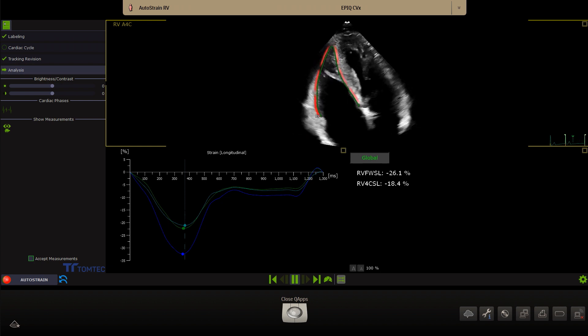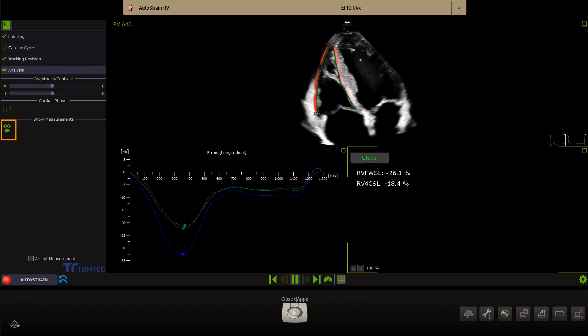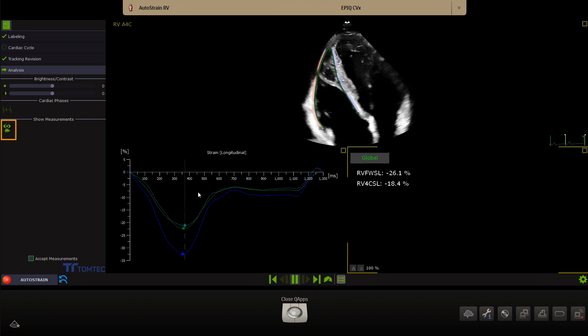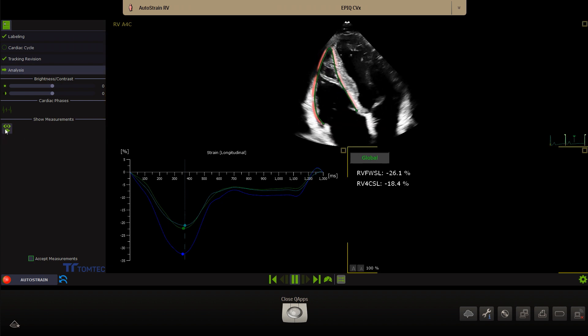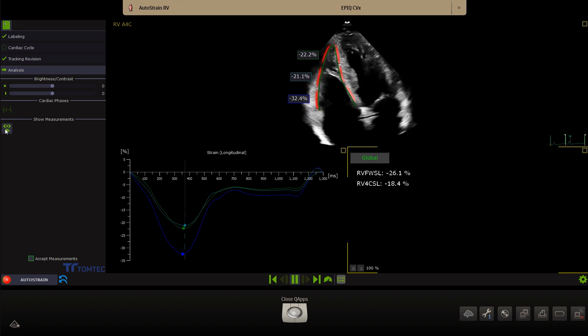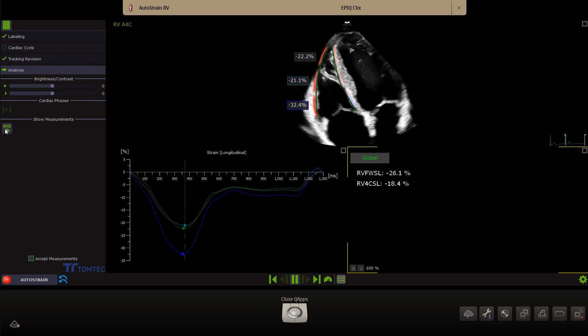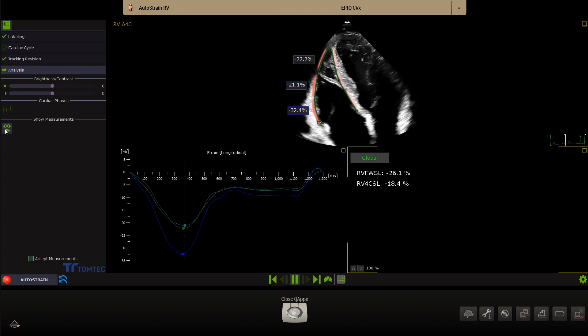Click on the icon Show measurements in the left panel to display the longitudinal strain of the apical, mid, and basal free wall.